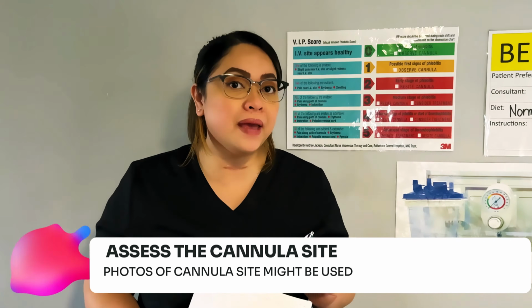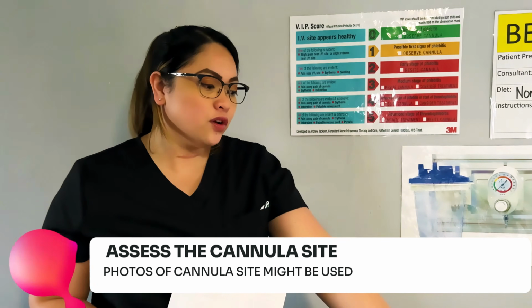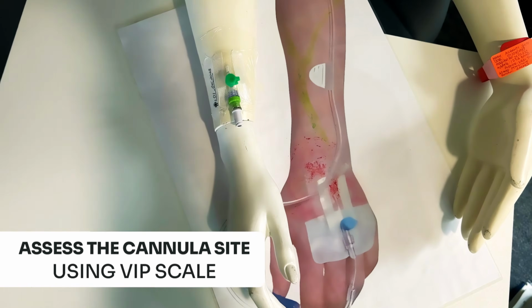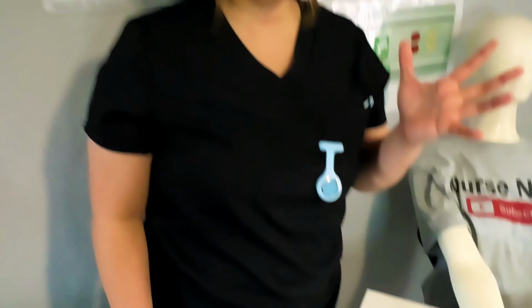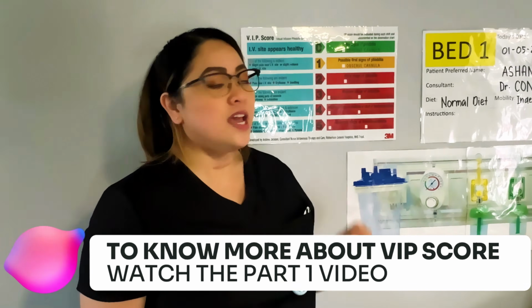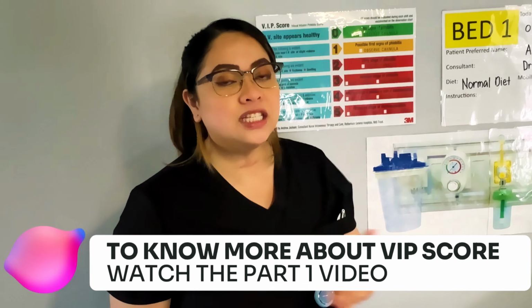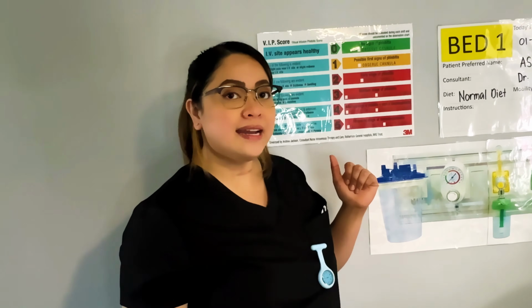Also, you will be given a picture which shows the condition of your patient. If you could have a look at this one. So we've got now a situation. This is now the picture in which we have to determine the VIP score of the patient. Also, the VIP scoring, I advise you to memorize this, just in case it's not in the exam center. If it is, then good for you, you're lucky. But if it's not, then at least you already have it in you. You have to memorize this.